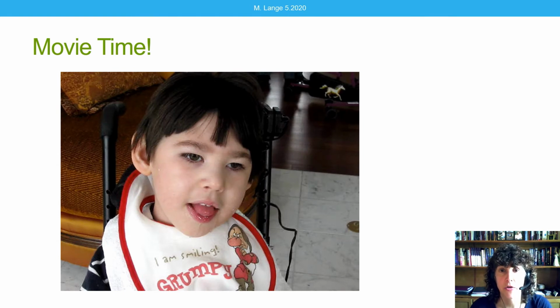So let's watch another brief video clip. This is, I'm blanking here, this is Chauncey, and at the time he's very small. It's a little hard to see because of his dark hair, but he has a black AbleNet spec switch also mounted off of his head supports, one of my favorite ways of mounting those switches, and we'll see what he does.